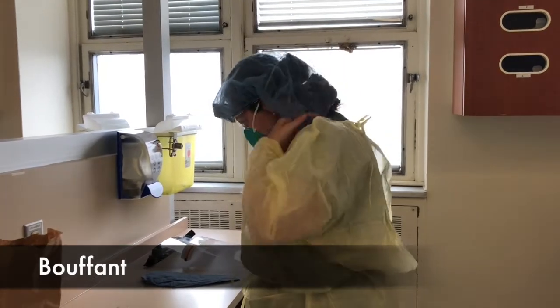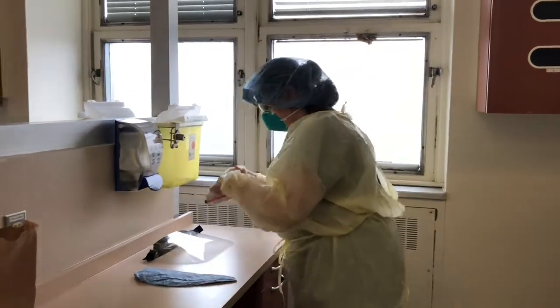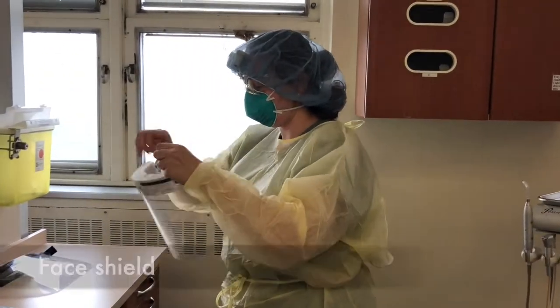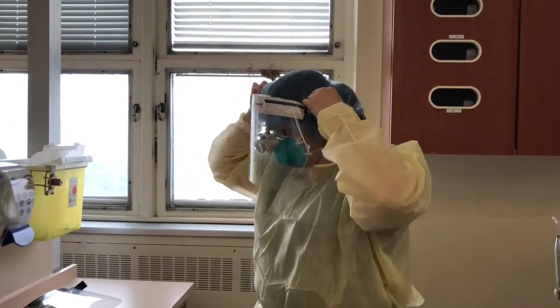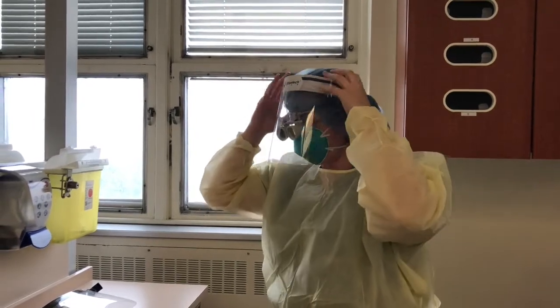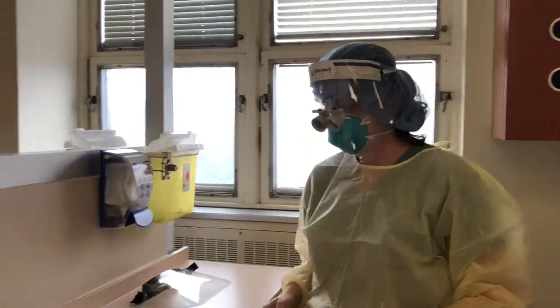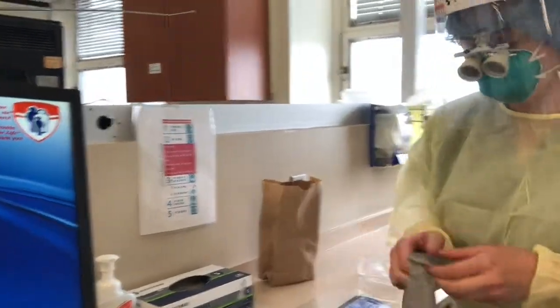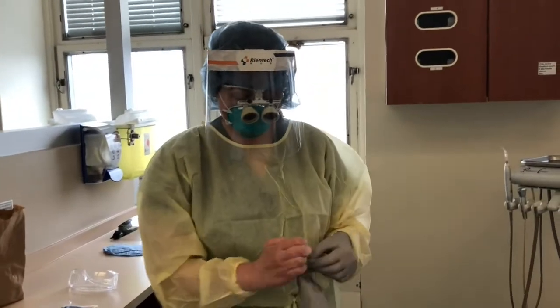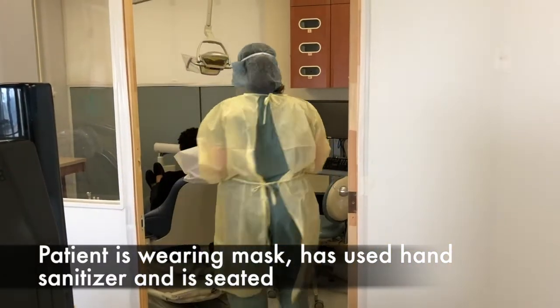Apply your head covering. Apply your face shield and adjust your PPE until it is comfortable. Lastly, apply your gloves, ensuring that they cover the wrists of your gown. Enter the treatment room and close the door behind you.